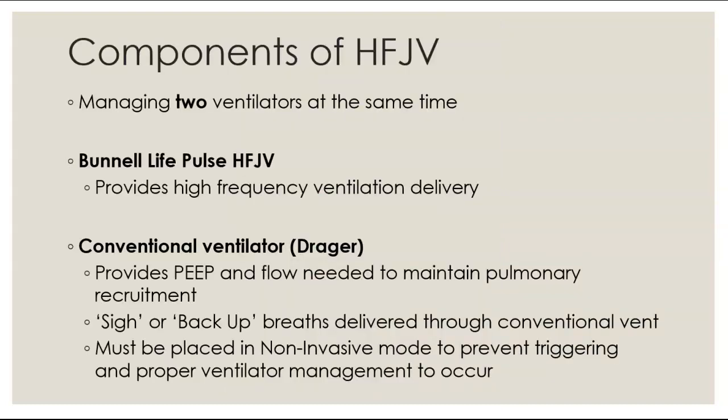So with the jet ventilator, you are managing two ventilators at the same exact time. You have the Bunnell Life Pulse High Frequency Jet Ventilator. Had to put the name because I have to give them credit for their equipment. This is what provides high frequency ventilation delivery. This is what gives us that high rate at a certain set PIP.